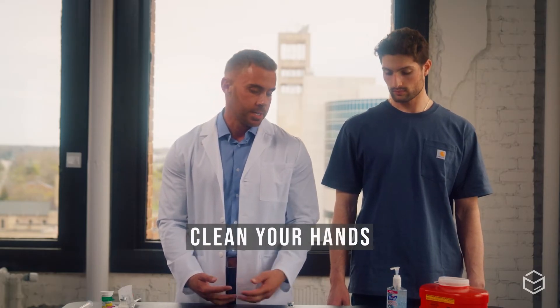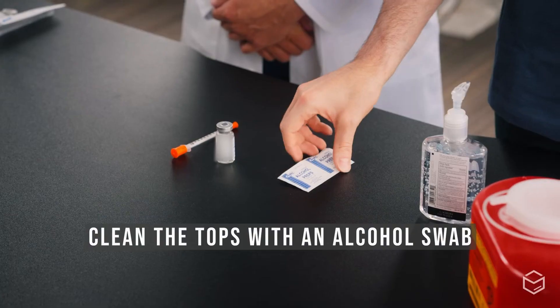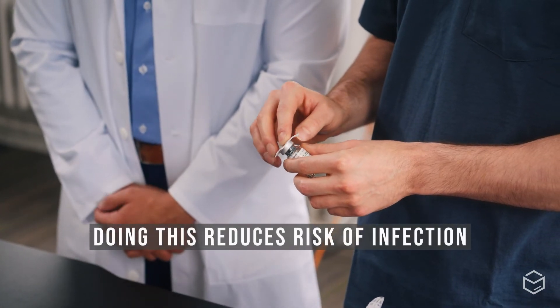Now Isaac will be demonstrating how to draw up the solution and self-administer a subcutaneous injection. First, he'll begin by sanitizing his hands — either with soap and water or hand sanitizer. Next, he'll take an alcohol swab and clean the top of the medication vial. Doing this limits the risk of infection.